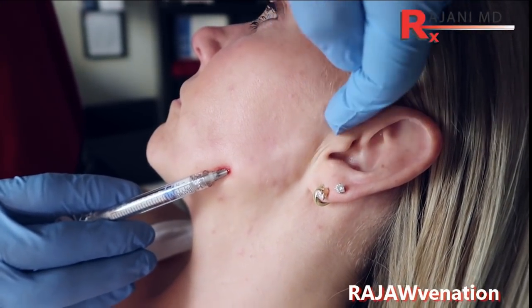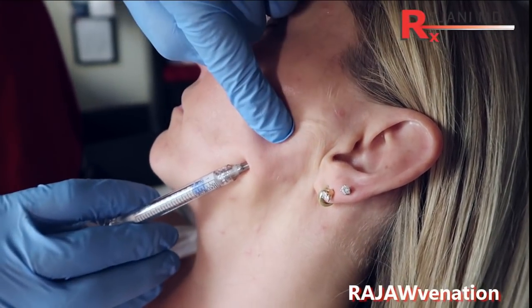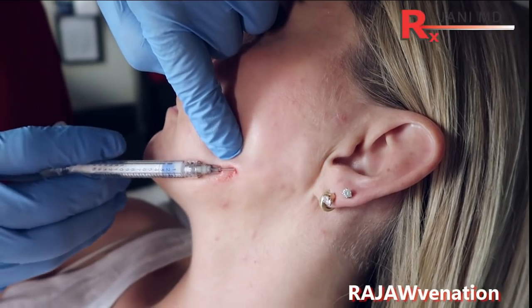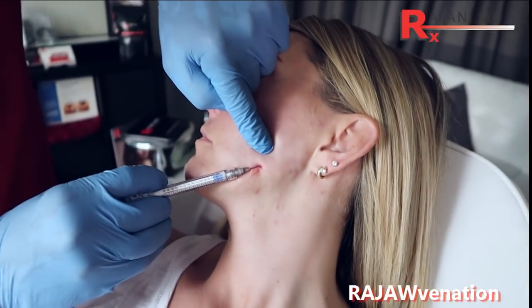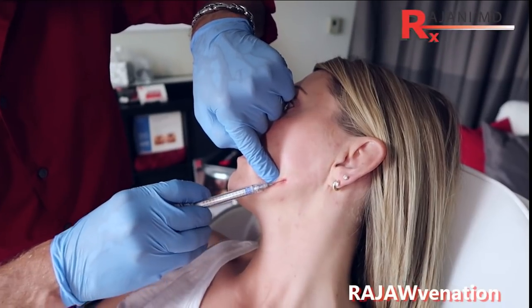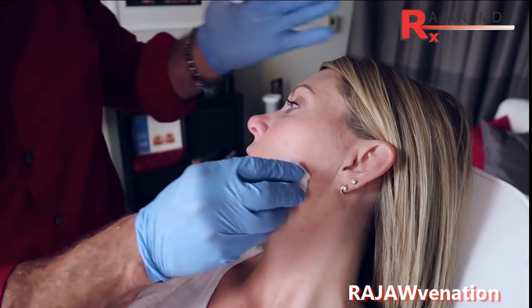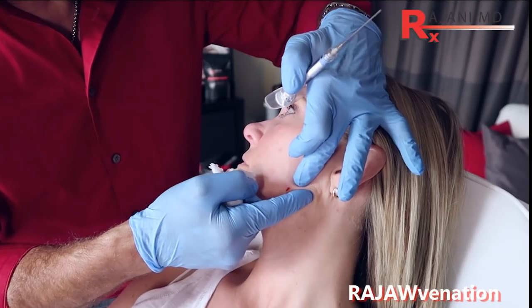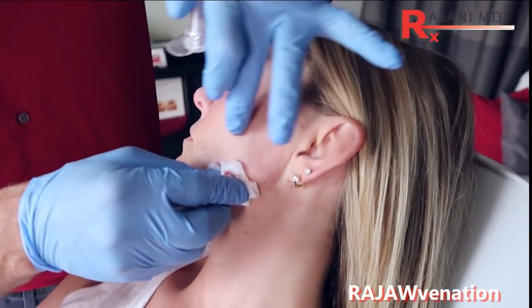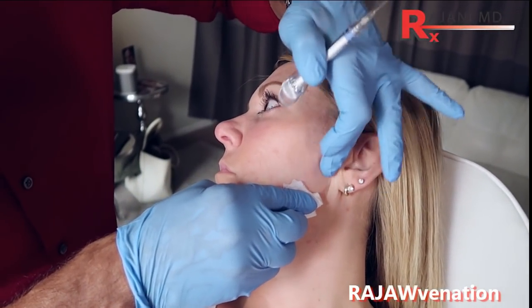When someone gets a facelift, it's in here that we're removing skin — so that's a good landmark to give an idea of what we're doing. We're really pulling back there by first adding volume. Unless there's a lot of loose skin, we can often do it with fillers and collagen stimulators. Radiesse will last long here because it's not a movement area — fillers go quicker where we're moving. We're on top of the parotid, and the parotid duct goes to the edge of the mouth, the oral commissure. So we're much posterior to the duct, but using the cannula is safer than the needle.